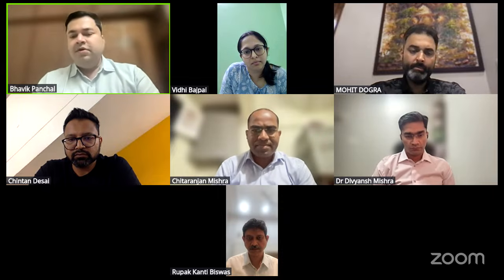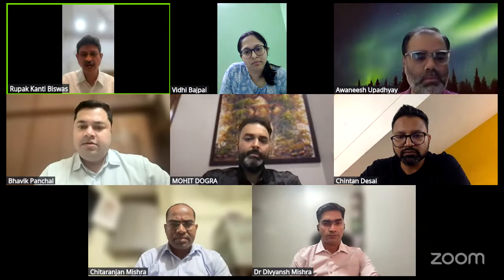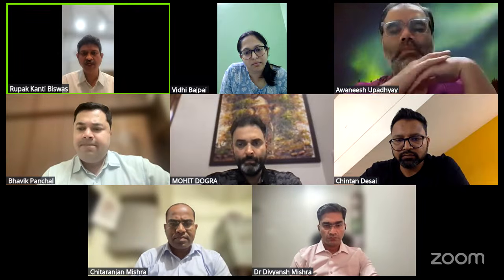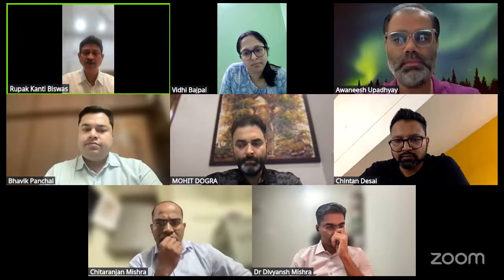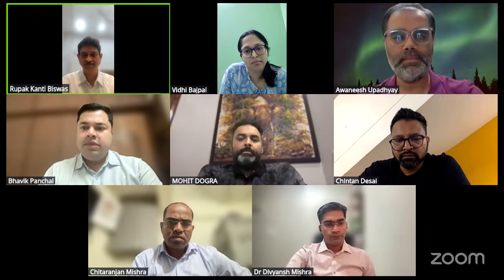Wonderful. Okay. Great. So, fine then. Dr. Bhavik, I just wanted to add one more point regarding myopic macular traction. If it is associated with a hole, probably I will do a larger size of the peeling. Even if it is associated with the inverted flap also, beyond that, I will try to release the ILM peeling as much as possible.